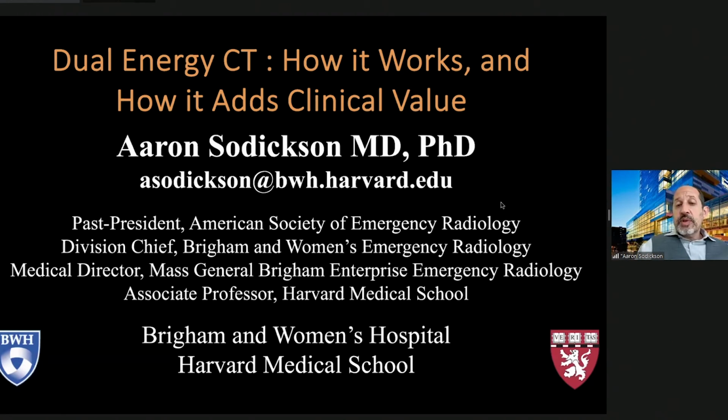Yeah, the downside is really just that there's a learning curve for adoption, and you have to sort out your workflow for creating these additional images, and you need your radiologist to understand what they're looking at so that they can interpret it properly.